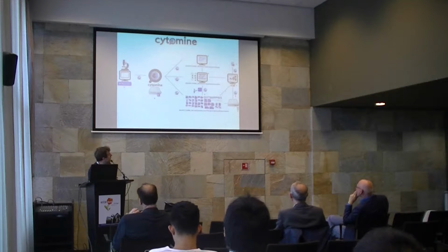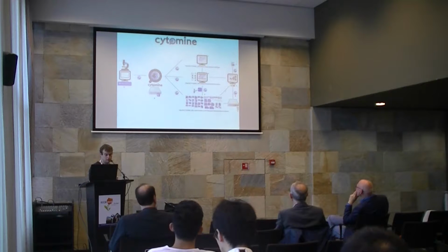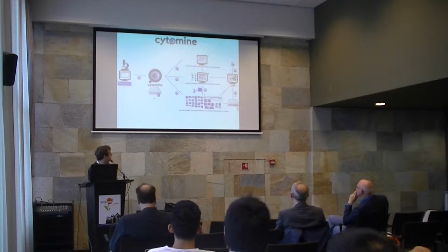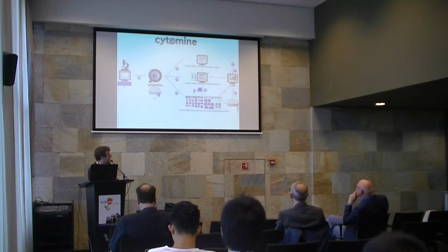It means that several people can annotate these images, so you can have several pathologists and several biomedical researchers looking at these images and annotating them, so that they can build ground-truth data. In this example, you have samples of tumor tissue regions and non-tumor regions. And all these annotations are exportable, so you can reuse them in other software.